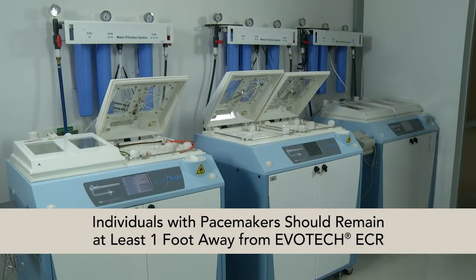Additionally, it is important to note that the EVOTECH ECR generates a magnetic field, so individuals with pacemakers should remain at least 1 foot away from the unit.